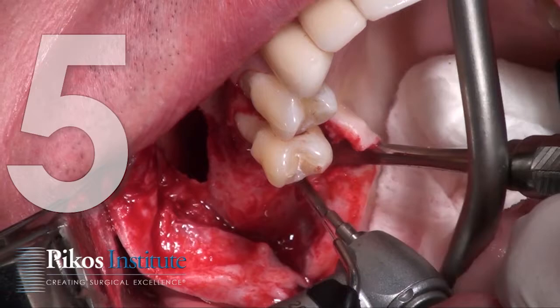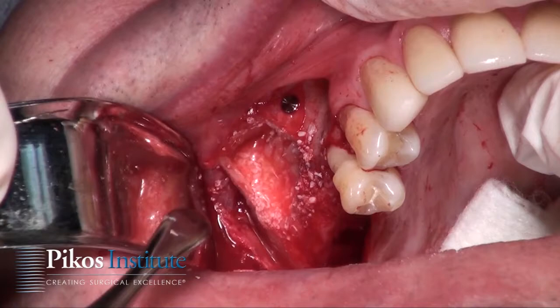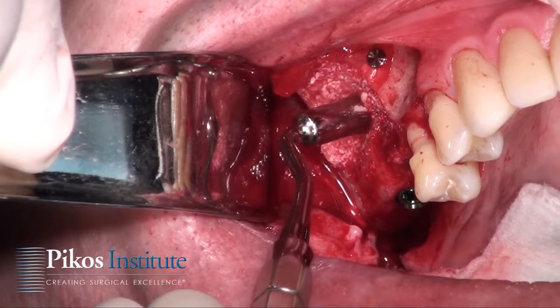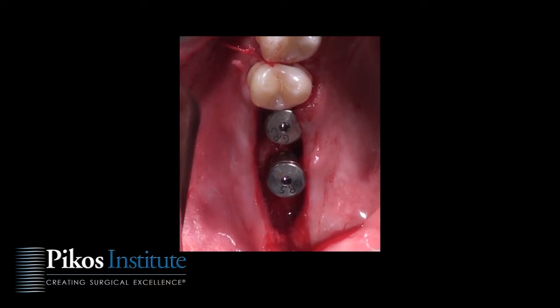Now we go to implant placement. Remember the sequence of events: outline the window, elevate the membrane, create osteotomies, then place the graft at about 80 to 90 percent volume into the sinus. The next step is to place the implants — the graft is already there — then regraft into and over the window, and if we're not doing lateral ridge augmentation, place a membrane over the window with fixation and close.